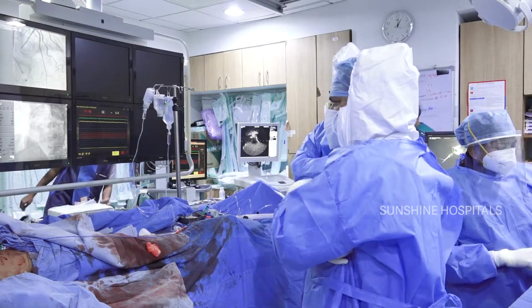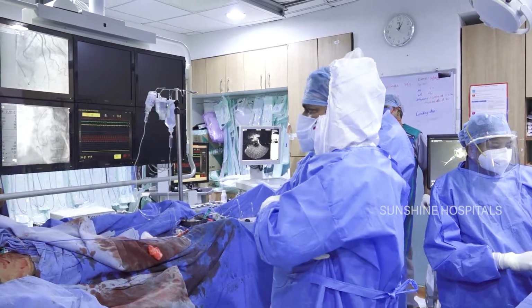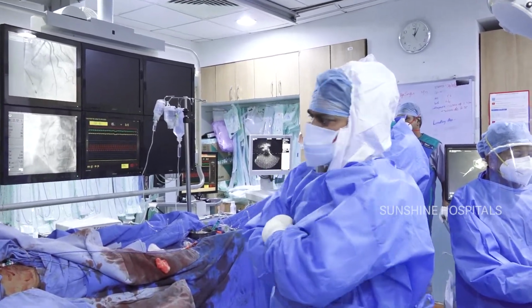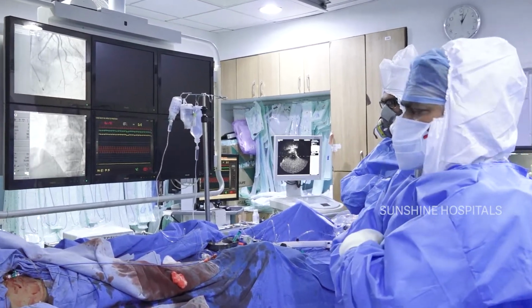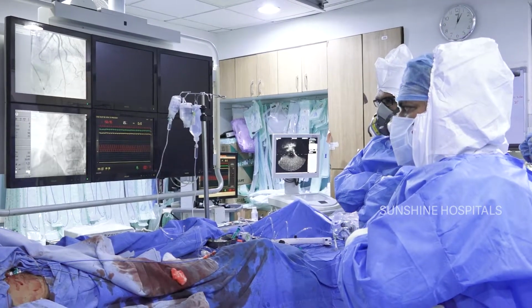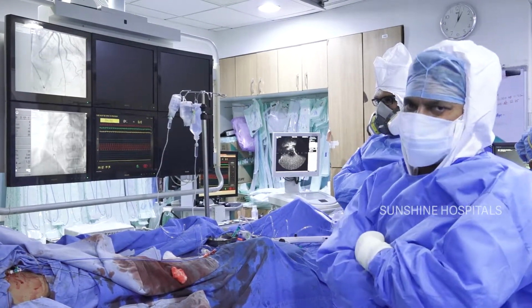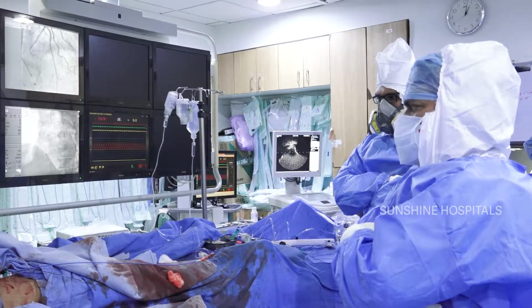Then this is the femoral. So we have put the balloon tipped pacemaker because the left circumflex is a bifurcation lesion, LAD diffuse lesion, balloon uncrossable lesion, and right coronary CTO. Because of that we thought, if no flow or slow flow develops, the patient's chance of developing complete heart block is very high.